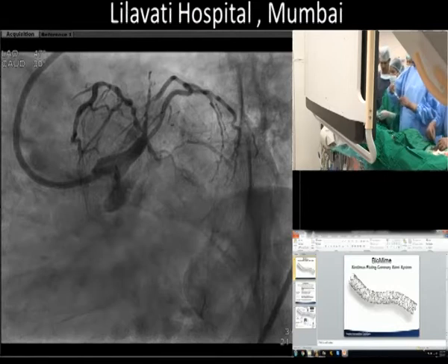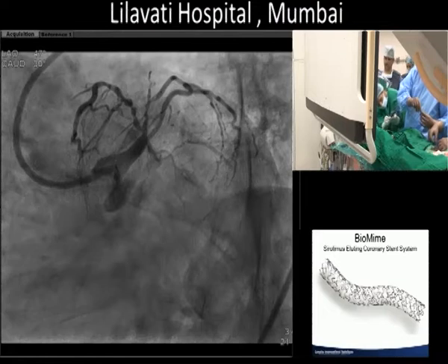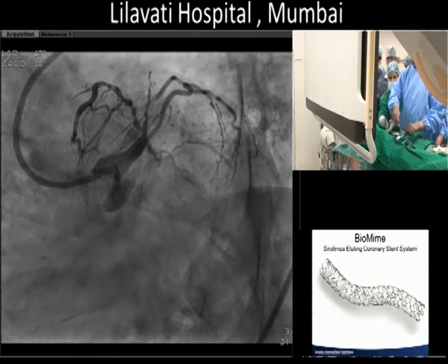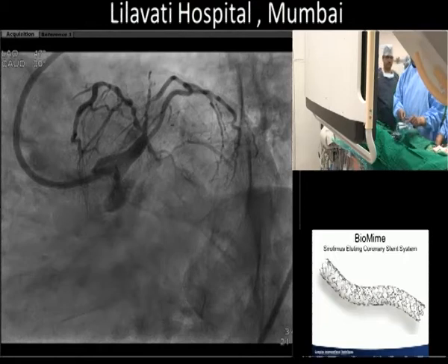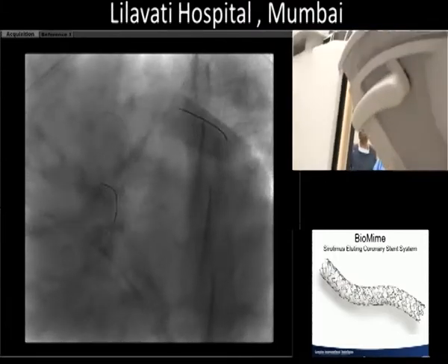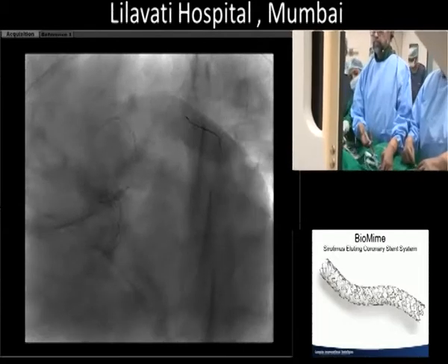And then what I might actually do is have a balloon in the LAD just so that I get as much of the diag as I possibly can without compromising the prox LAD. It sounds like you're using a 7 French guide. Yeah, that's a very, very reasonable thought.